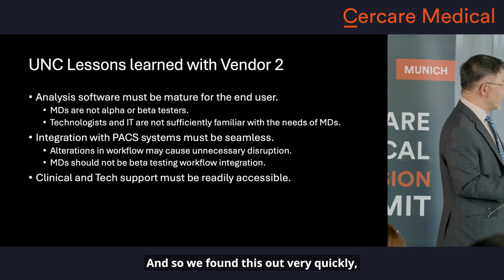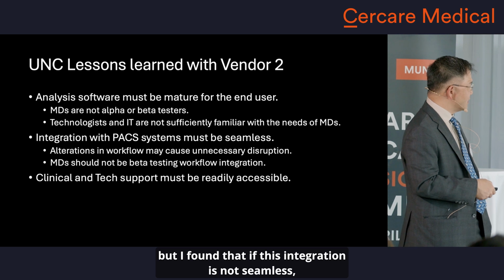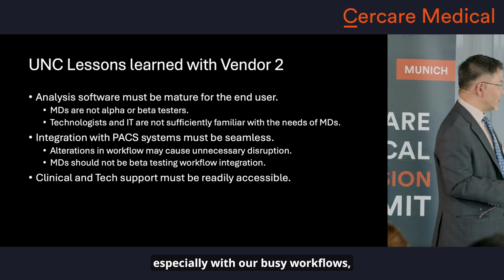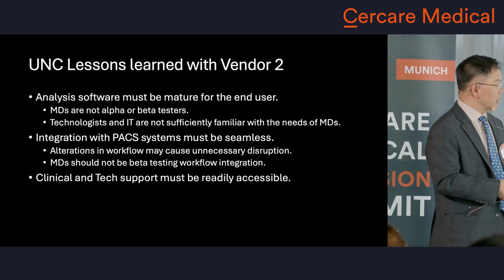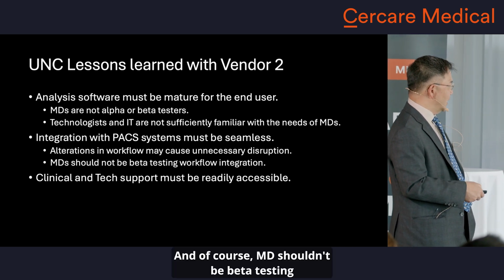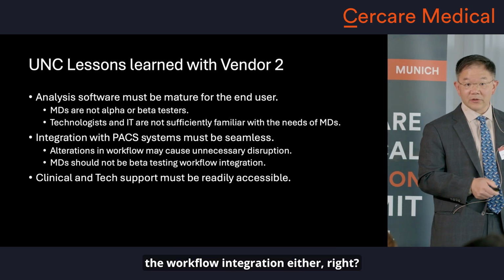And so we found this out very quickly, like I said, as an example. I found that if this integration is not seamless, if it causes us even half a delay, especially with our busy workflows, it's not going to be accepted no matter what. And so I think that's another critical issue. It depends on your PACS, and of course on what software you're talking about, but that was critically important for us. And of course, MD shouldn't be beta testing the workflow integration either, right?